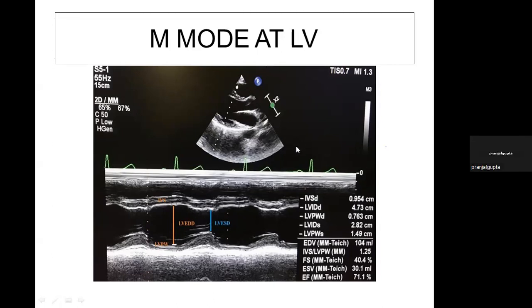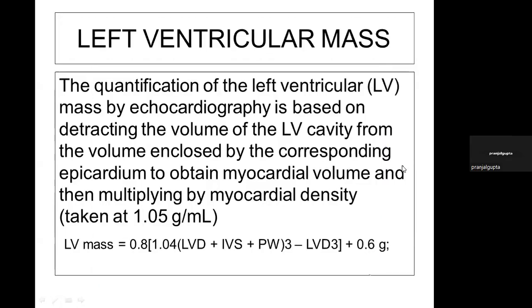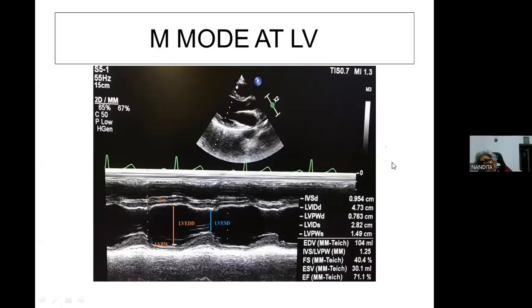You will have difficulty. As sir has already said, about 45% of patients give you a good window. The rest 55% do not give you a good window. So go into the field thinking that you are not going to get a good window, and you have to improvise. You have to go to other windows. In COPD patients, you will never get a parasternal window; you are always working with apical and subcostal windows. So you have to improvise, and mention in your report from which window what was done, if it's not conventional. In COPD, it comes at the epigastrium.